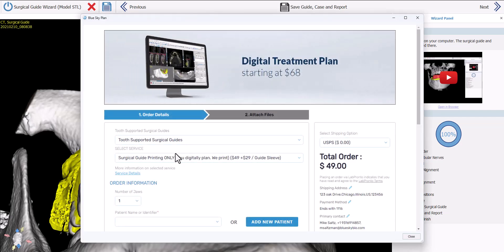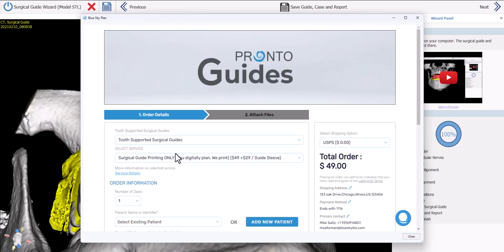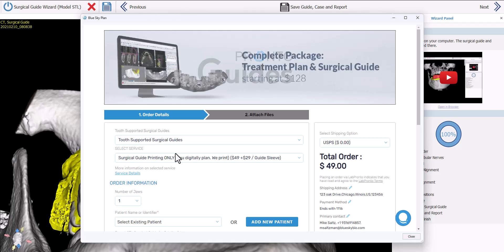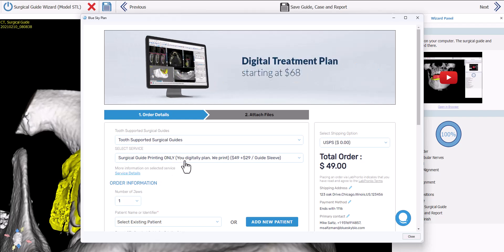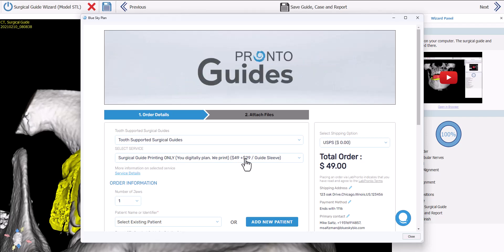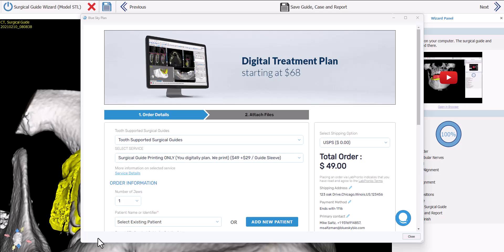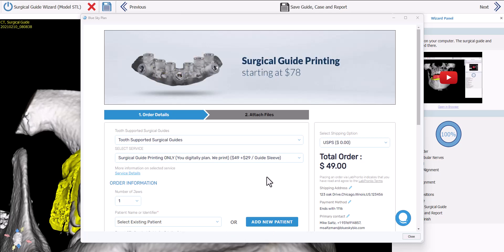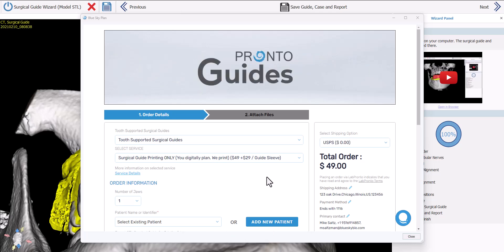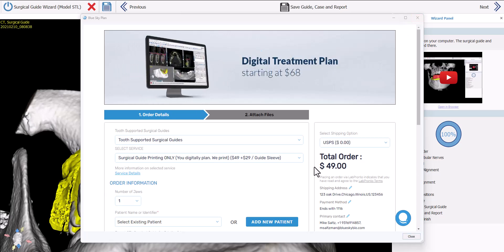The software offers the option of having the surgical guide you just designed manufactured. If you're not printing in-house and would like to order the surgical guide, you can do so directly from the prescription form. The price is $49 plus $29 per implant. This is a fantastic alternative — the surgical guide will be manufactured and sent to you. Click Close or exit if this isn't relevant.